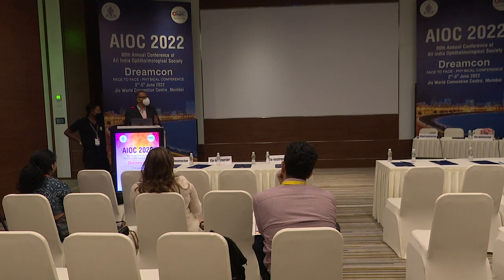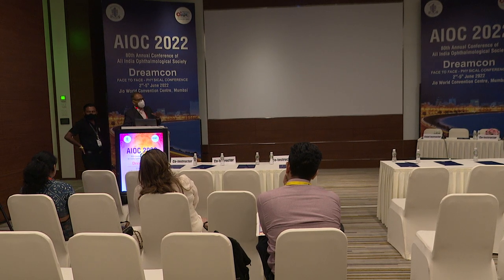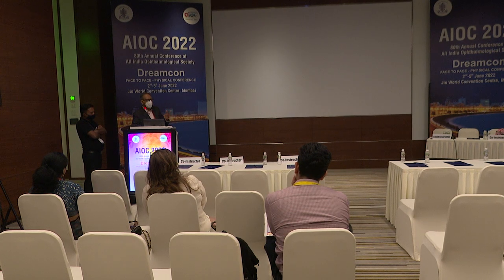I think till 3 years back, we were doing the same. But now what we have realized lately is that you have to identify these calcified subcapsular plaques. They are different than fibrotic ones. So in these calcified subcapsular plaques, there are adhesions in the subcapsular area, and these are calcified ones.